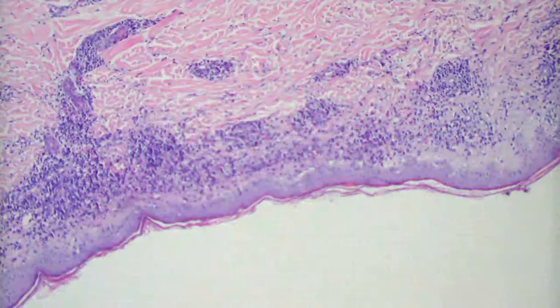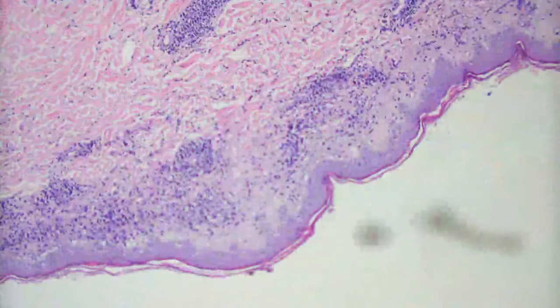You have a special stain to prove that it was syphilis in this case. I'll show you that in a second. So again, when you see this many plasma cells, and it's not on a mucous membrane, and it's not associated with something on the face like seborrheic dermatitis, you should at least think about syphilis. And here is the stain. We have two stains that we use today primarily. You can use a Warthin-Starry stain, which is not that great, or you can use a Treponema pallidum stain. And supposedly this one's positive.